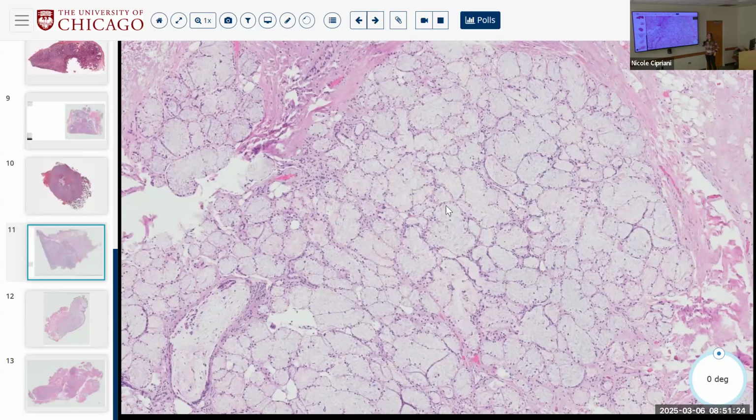Submandibular is not really connected to mucosa. So submandibular is more adjacent to skin, and it is going to have mixed serous and mucinous. Sublingual is more close to mucosa, right? Because you kind of get mucosa, sublingual, submandibular, skin, right? So it could be sublingual, although sublingual arguably also has a small proportion of serous cells.